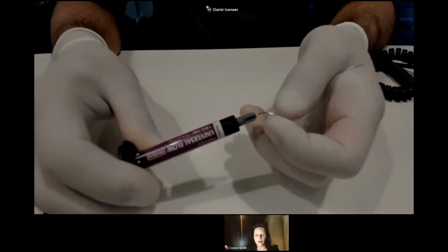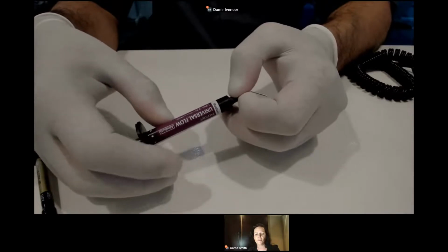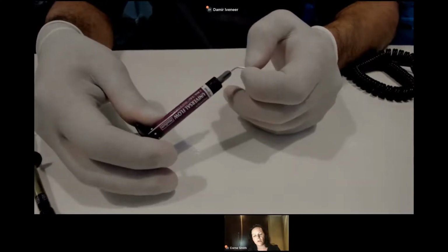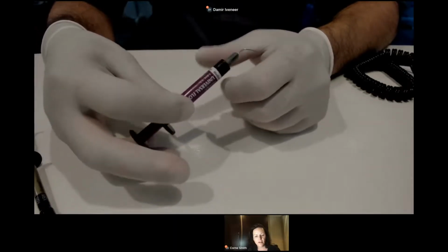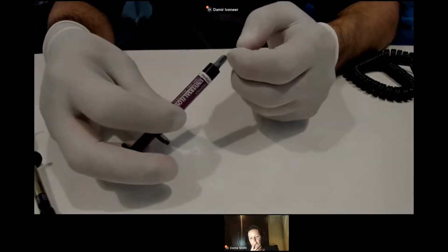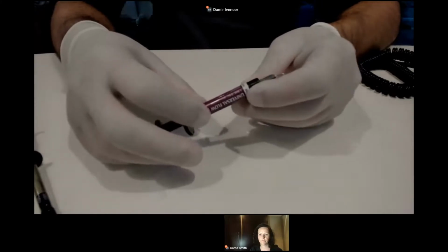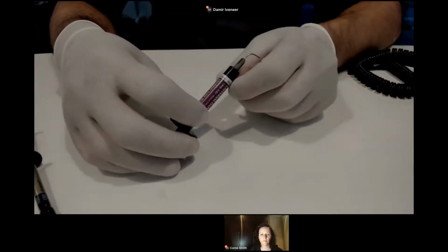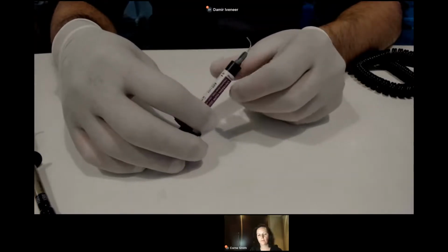And what you want to look out for when you choose your flowable is to make sure that you have different options in your translucency. So you want to have a body shade, and you also want to have an enamel shade that you can use. Exactly. Because you want to play with different types of translucencies. So me personally, when we use flowable composite, and I mentioned it in the lecture, we have to make sure that we use the flowable composite from the next generation. They must have a high filler content, which means between 60 to 80% filler content, okay?